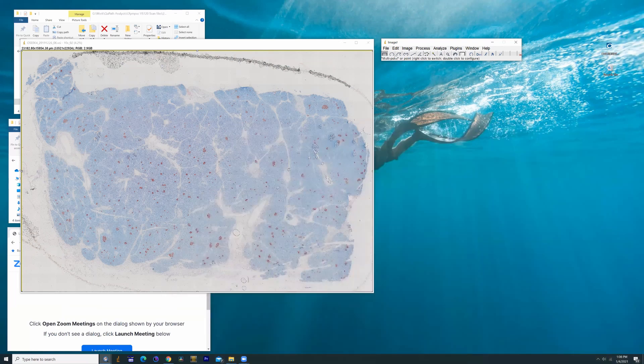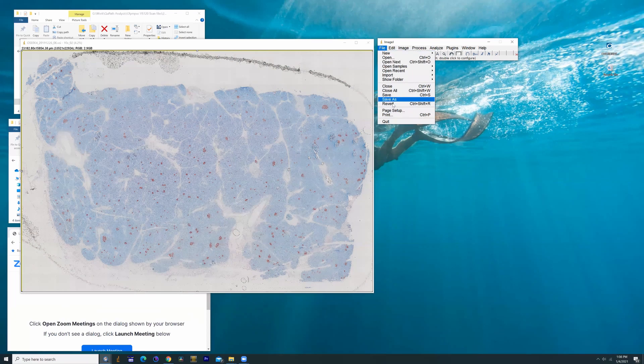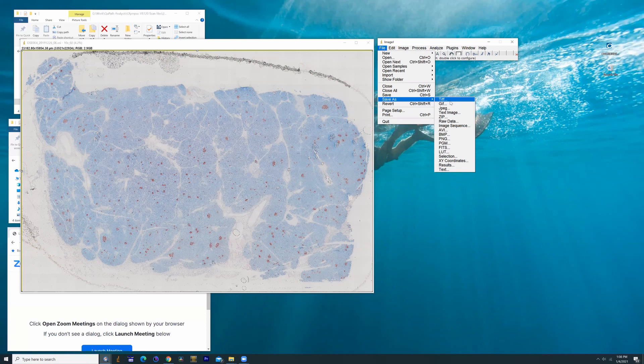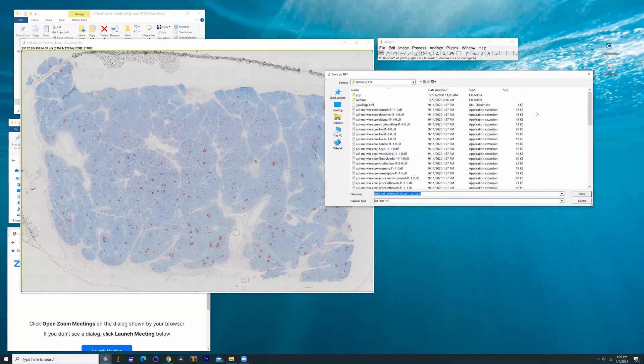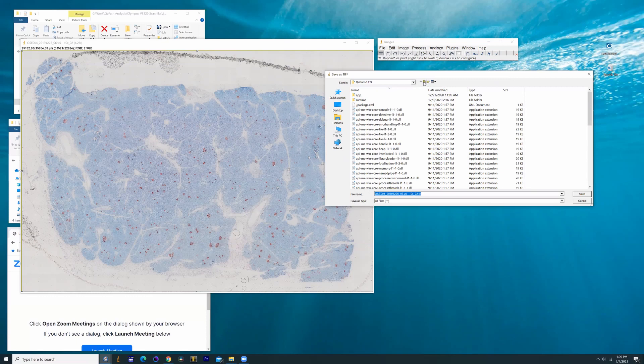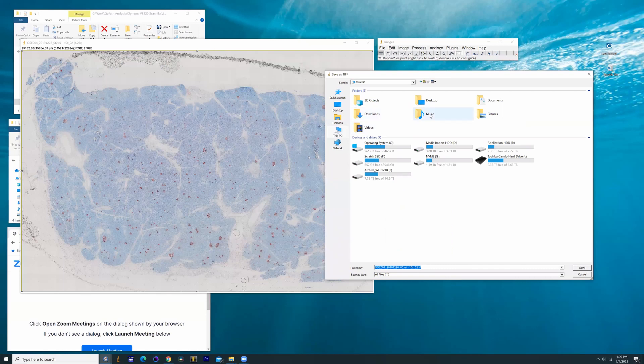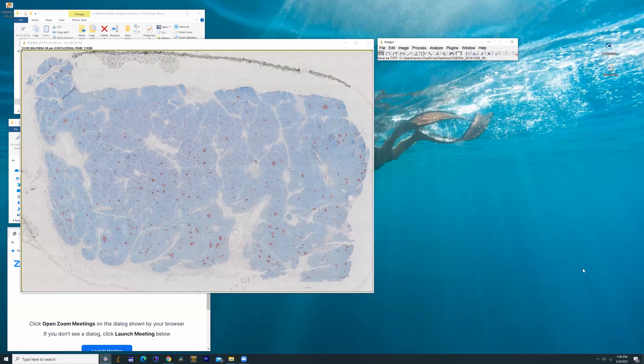If you are interested in taking this file into another format beyond ImageJ, we now can save the file in whichever format. I actually recommend maintaining a TIFF format. Most of these other formats utilize a form of compression. TIFF is a less compressed version we can utilize for analysis and some other secondary software. Let's go to the desktop, type in TIFF, save.